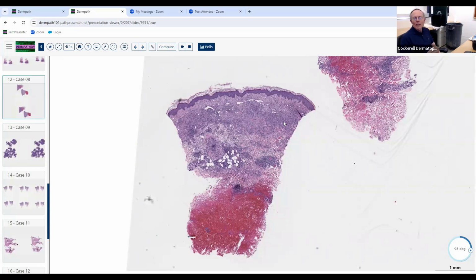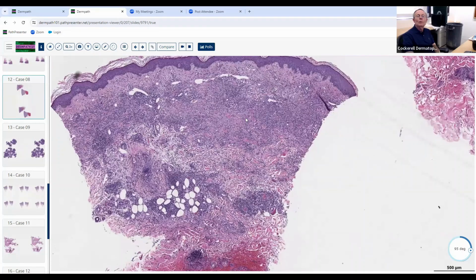You're not going to spend a lot of wasted time thinking about spongiotic dermatitis and things like that. You're going to say, I'm going to be searching for an infectious disease. I'm going to look and see what the pattern of the granulomatous inflammation is. Is it a palisading granulomatous process? Is it sarcoidal like the last case? Is it more suppurative granulomatous? You might see that with something like a deep fungal infection. If it has a tuberculoid pattern, I'm going to look for maybe something like an AFB infection. So it's helpful to narrow you down, and then you can zoom in and make a specific diagnosis. So here we've again got a granulomatous inflammatory reaction.